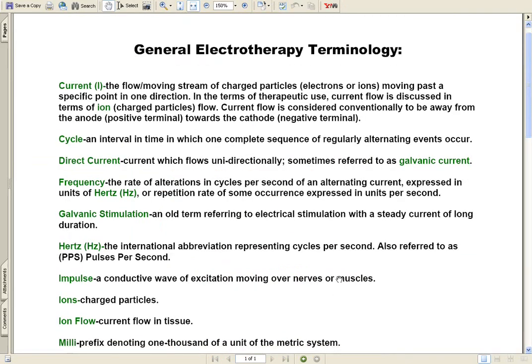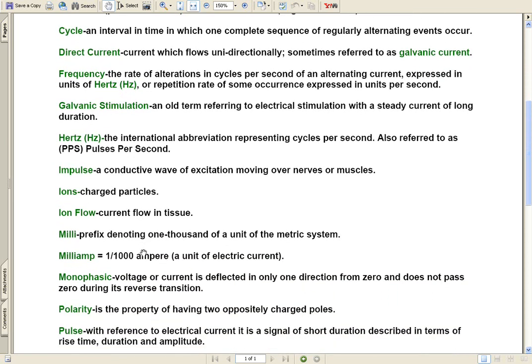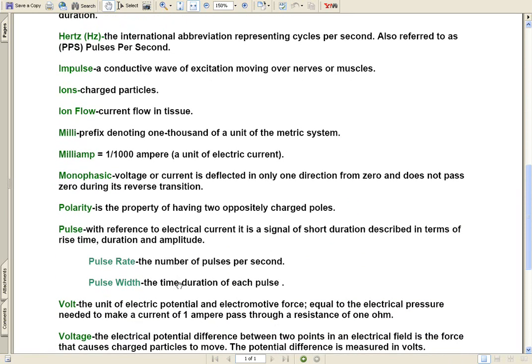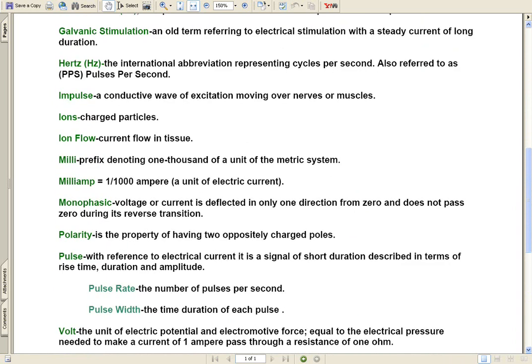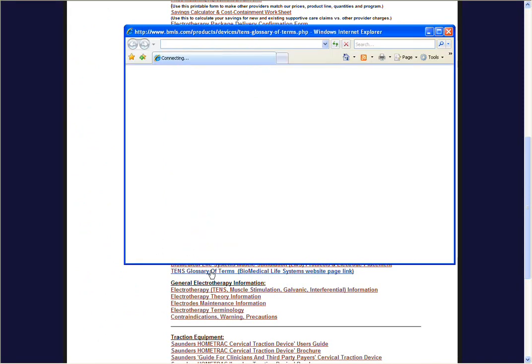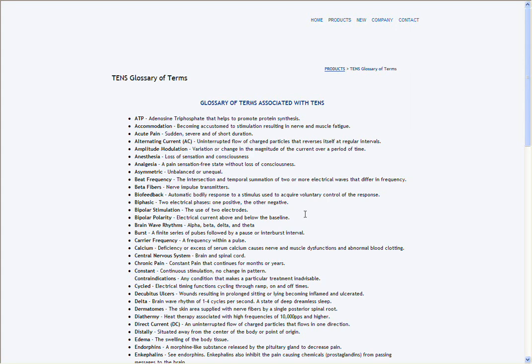Again, you're going to have frequency or hertz, milliamps. That's the same for most all these devices. Pulses, pulse rate, and pulse width. Mostly going to be determined by your physician. Click off that. If you want a better explanation, you can go over to the biomedical life system glossary of terms and conditions. Not every one of these terms is going to apply to your specific device or that mode, but it's good to look at these. Just want to show you that you have access to this on the internet.